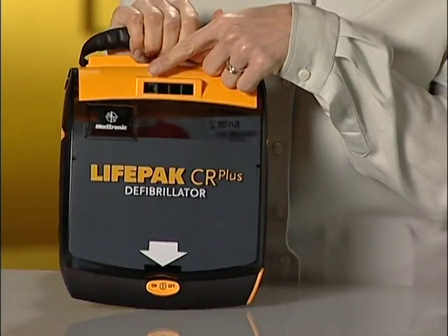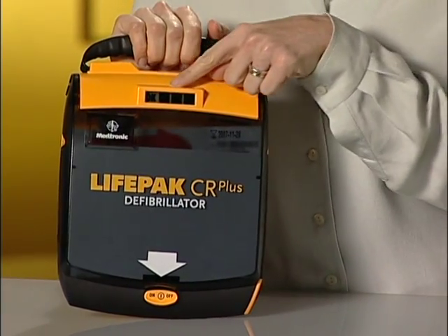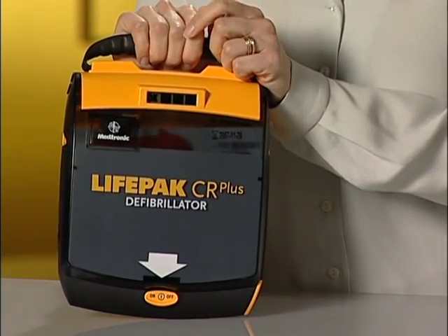The LifePAK AED is easy to maintain. It does its own self-test at regular intervals to be sure it's ready. If it senses anything you should know about, it will change the OK symbol, here, to another symbol. You should check this display periodically to make sure it says OK. If you see another symbol instead of OK, look it up in the manual to see what it means and what you should do about it.